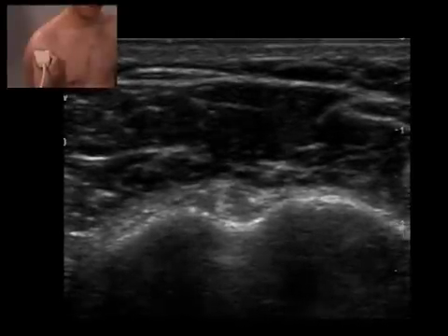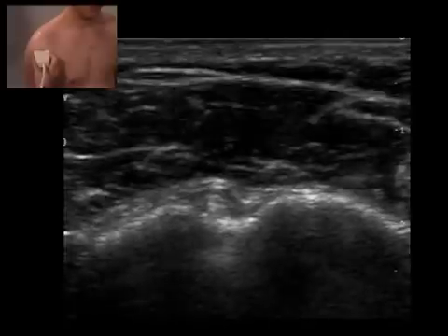The probe is moved superiorly and inferiorly to assess the integrity of the biceps tendon.